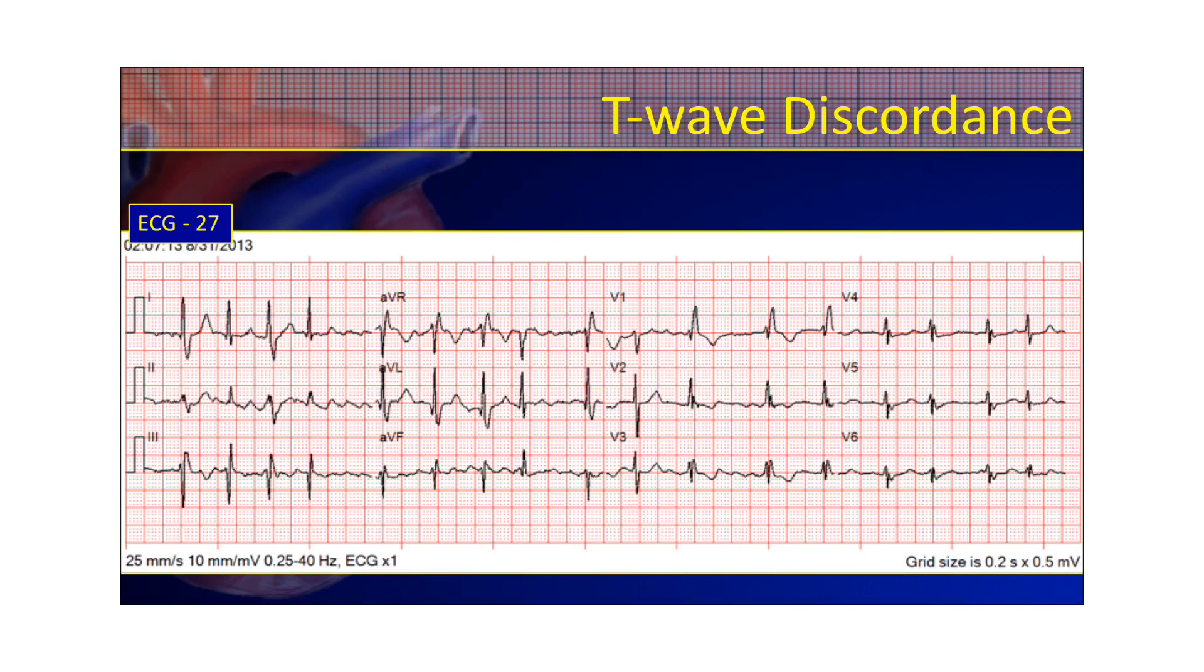Here we have a patient with a right bundle branch block. And what you see is a positive terminal wave and a negative T-wave. That is normal T-wave discordance. If that T-wave was positive with a right bundle branch block, and the ST segment was elevated, you'd probably be dealing with a myocardial infarction. That would be abnormal T-wave concordance for a bundle branch block to have concordant T-waves. It would be abnormal.